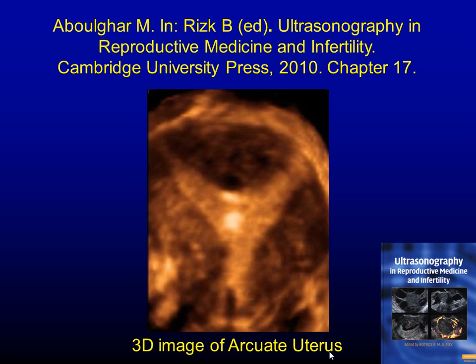The cornua is here, the cornua is there. You join your line, you drop the midpoint down here. Not even that, the line really is cathedral looking, convex upwards. It is not really a flat line in reality. It depends, however, how much distension fluid you put. So if you're doing an X-ray on this patient and push more fluid, it will flatten up.